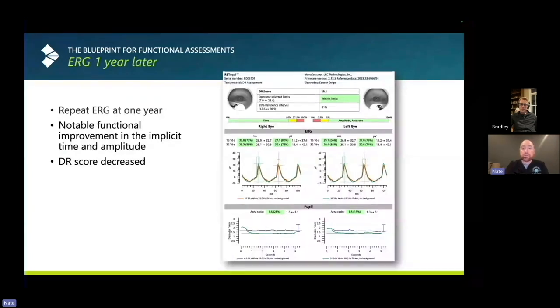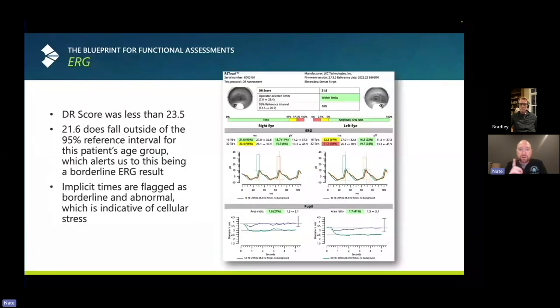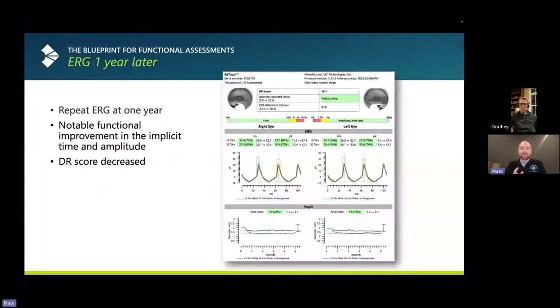And look at the qualitative difference. Ignore the number, even though that's the most important, I think, is the number. But ignore the number in this case and just look at the waveforms. Look at those qualitative waveforms from this to that. Significantly improved. Again, he took the supplement. A1C was not changed, but we are moving things in the right direction. He was thrilled. Guess what his visual acuity was? It was 20/30 plus, and it was 20/30 plus a year later.